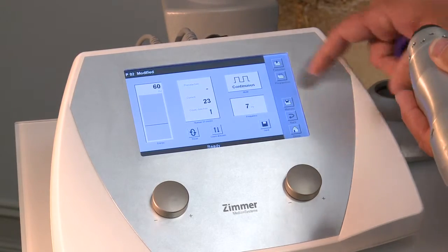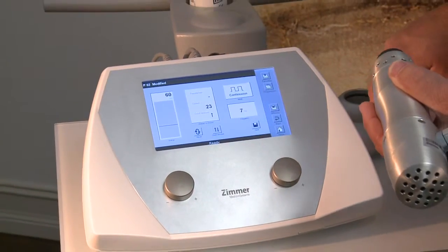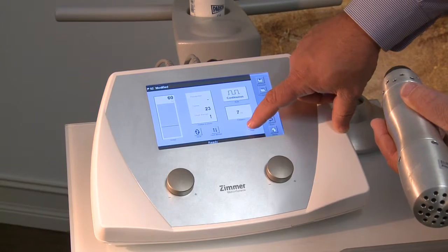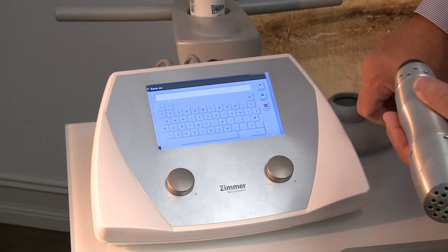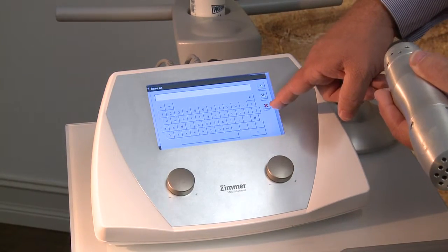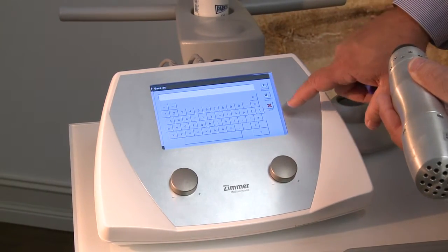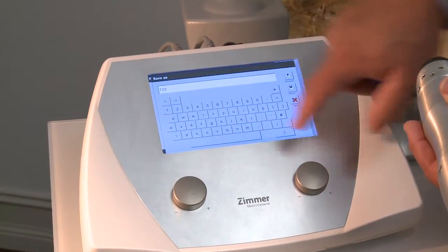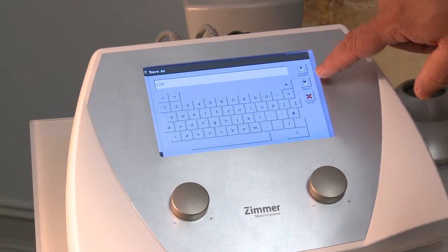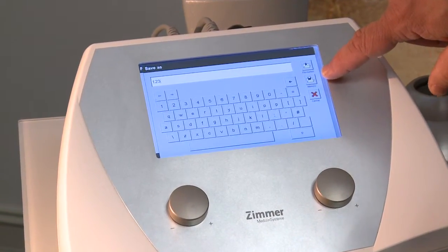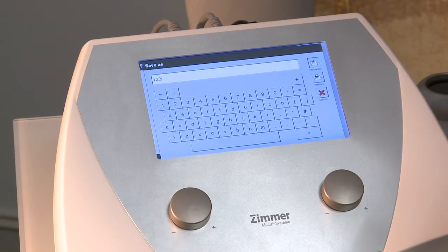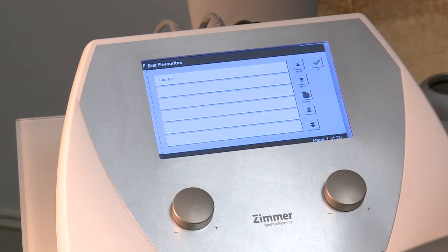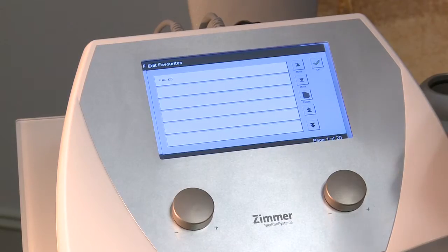If you go back to continuous mode, it simply goes continuous until you take your foot off the foot switch. At the end of the treatment, if you have a set of parameters you particularly like, you can push save, type in the name of the protocol, and put it either into your favorites or into memory for future use.